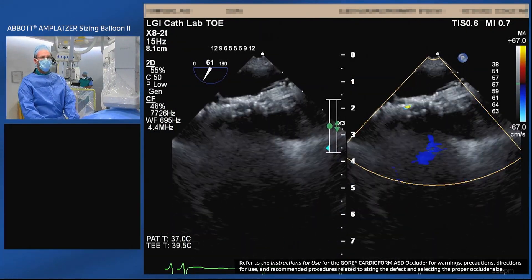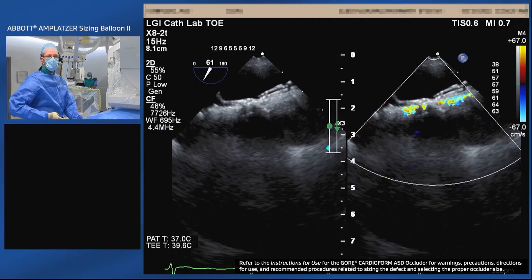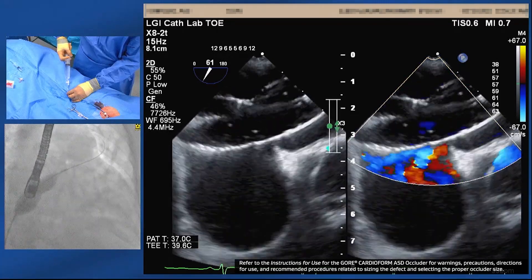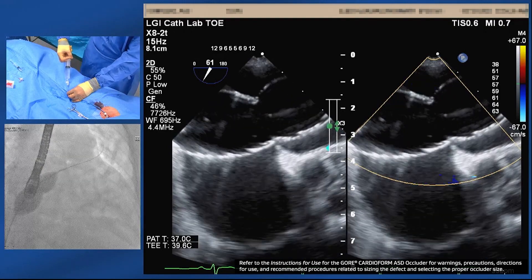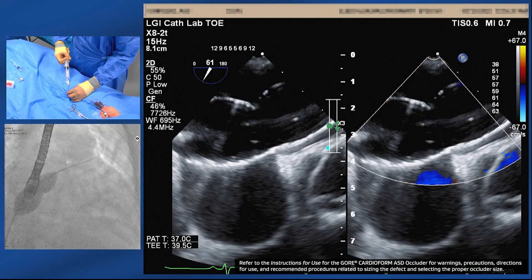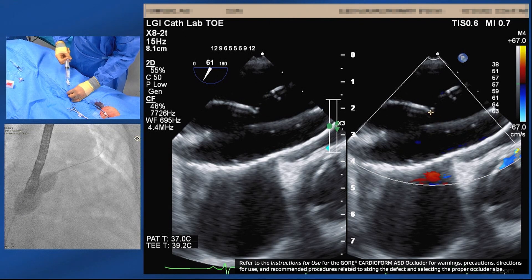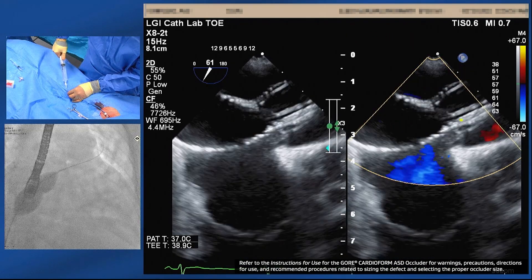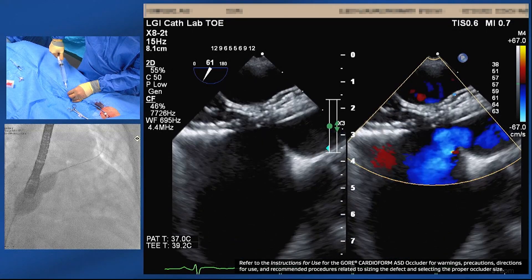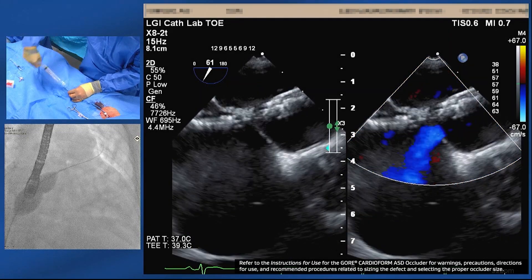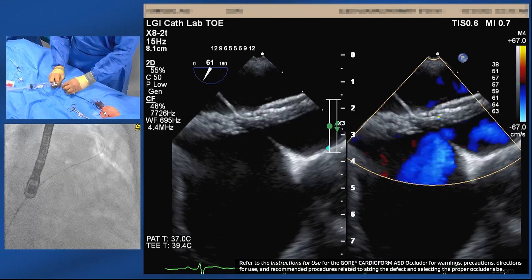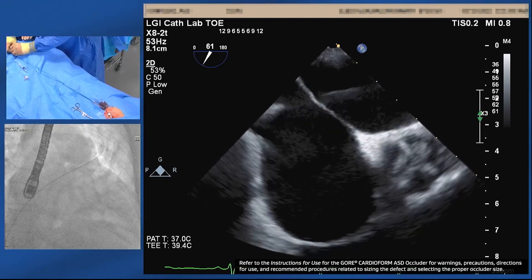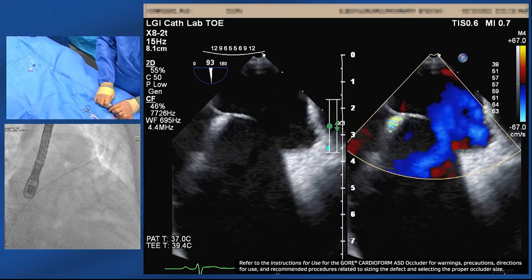We've got a 34-millimeter AGA sizing balloon brought across the defect. Inflating the balloon until we stop flow — that's stopped. Measuring now: 17 millimeters. So we're getting similar measurements without the balloon as with the balloon. We still size defects for this device to increase confidence, but generally the measurements between TOE without balloon sizing are very similar to what we get with the sizing balloon.